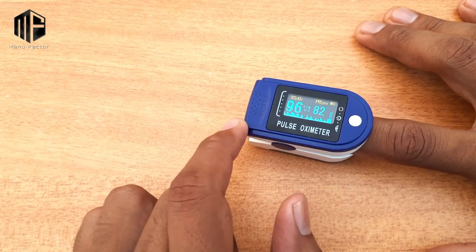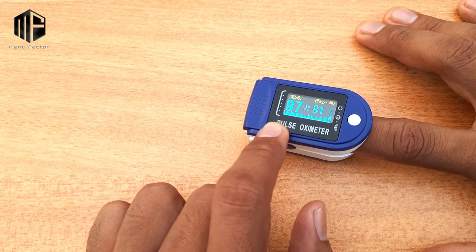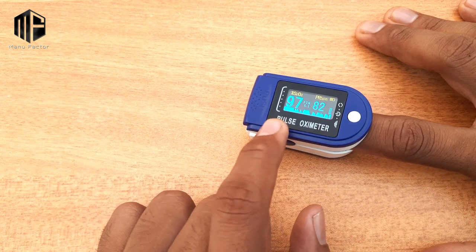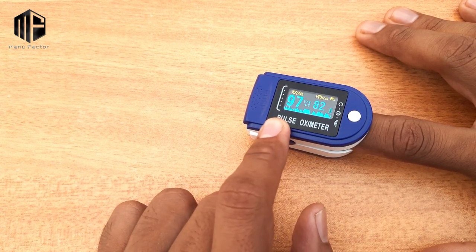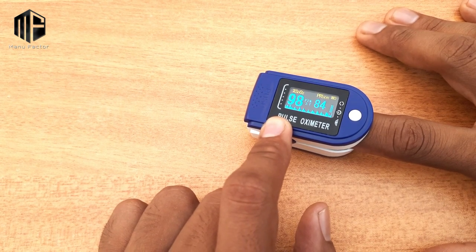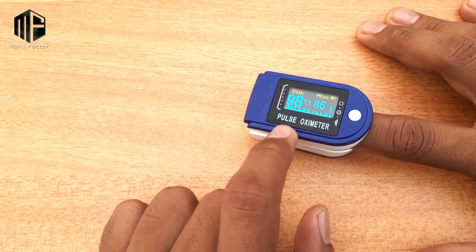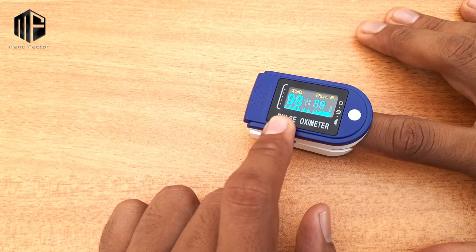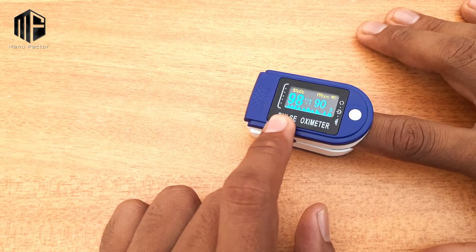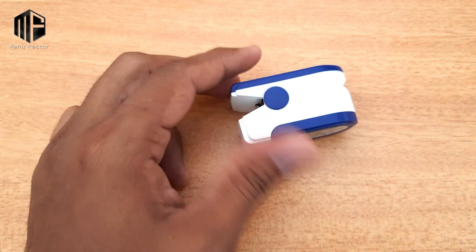Now the blood reading is 96%. If you are a COVID patient, this is a good way to check. It is very sensitive. If you are a COVID patient, we can check with this device. That is the alarm feature of this device — this is a feature of the SITIAN brand.